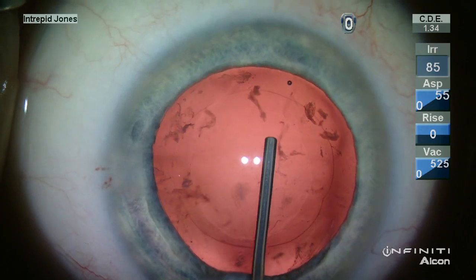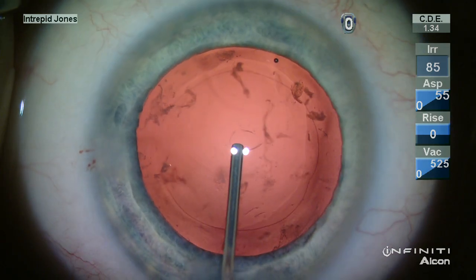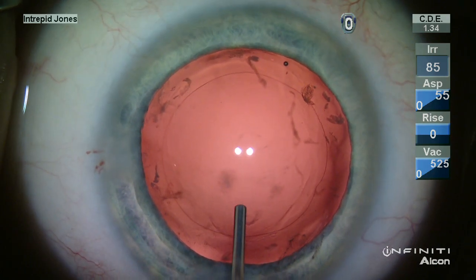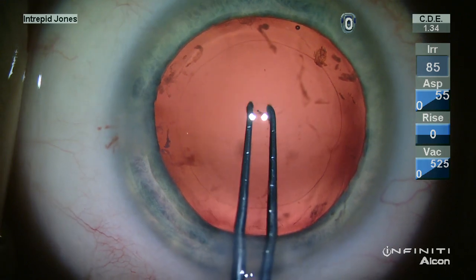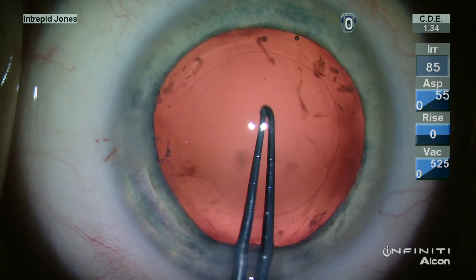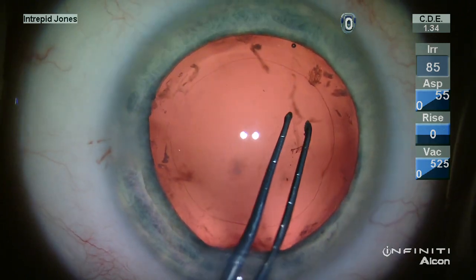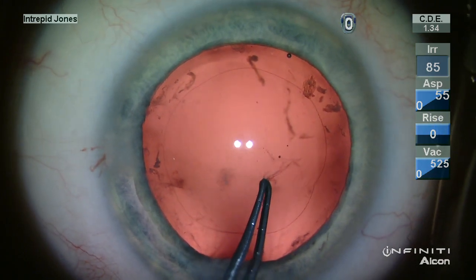I then place OVD into Berger's space, and then placing additional OVD both anterior and posterior to the posterior capsule. I can then use my standard Utrata forceps to fashion a posterior capsulotomy.